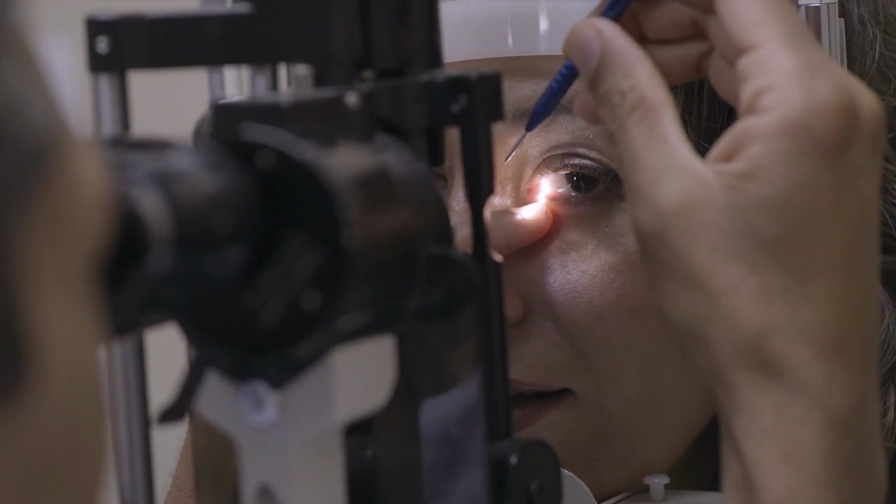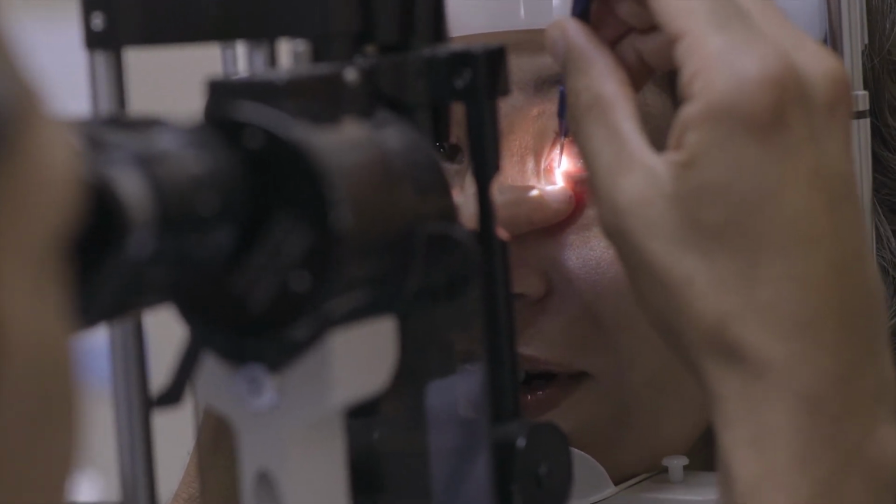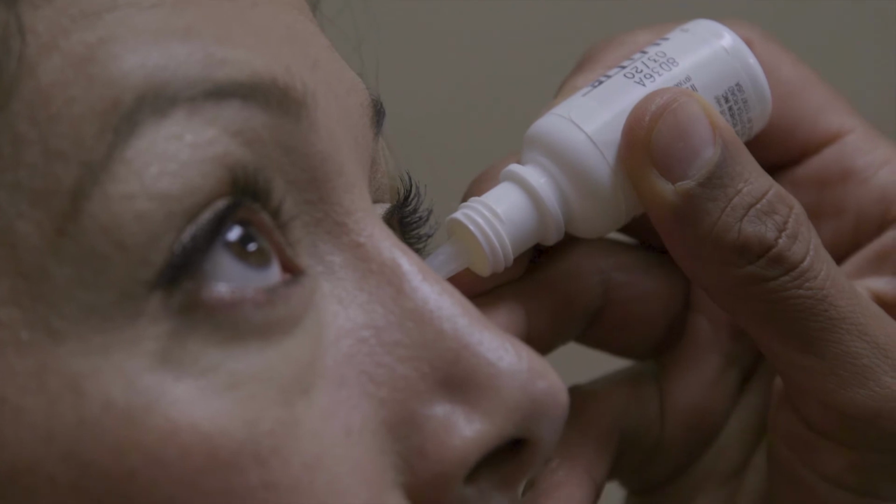Is that uncomfortable? Yeah. Okay, I won't put it in here. The stretch. So the whole purpose of that exercise is to figure out what the size was, and you want to match it. I would say you're a 4 or 5, you know. So you would put a 0.5 in, that would probably be a good fit. Okay. 4 would probably work for me. That's why it's hurting.